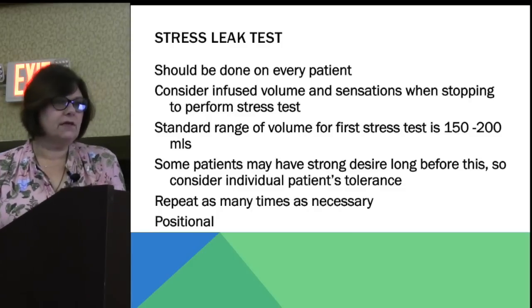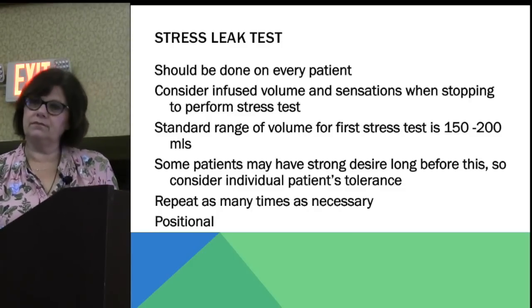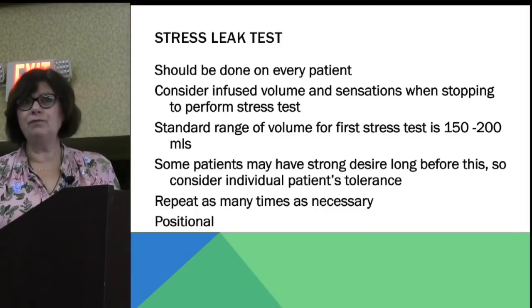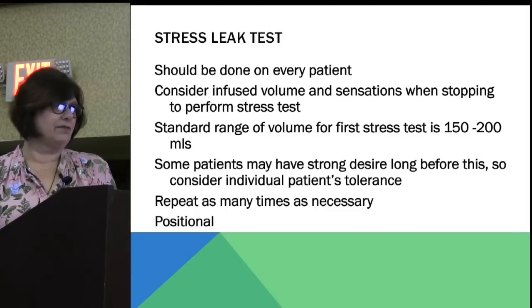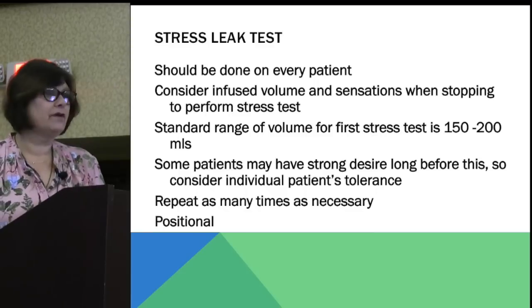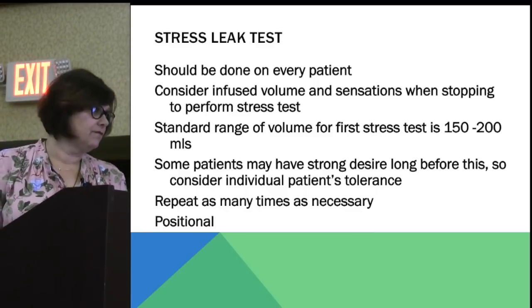So if they start saying, I'm getting really full, stop then and do your first stress test. And you can repeat the stress test several times throughout the infusion, as many times as you feel is necessary. I usually go about every 100 mLs, but do whatever you're comfortable with and whatever your patient's comfortable with.